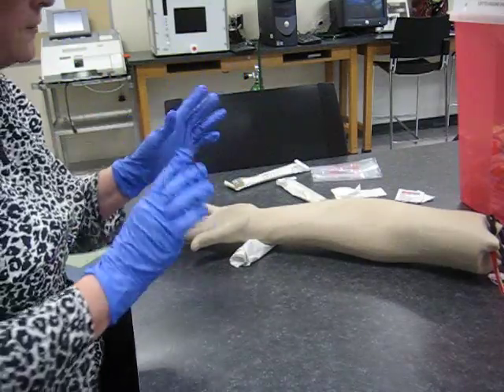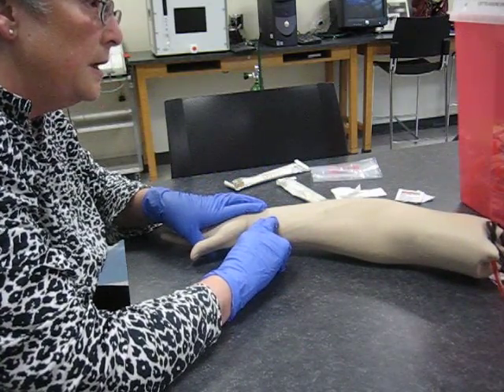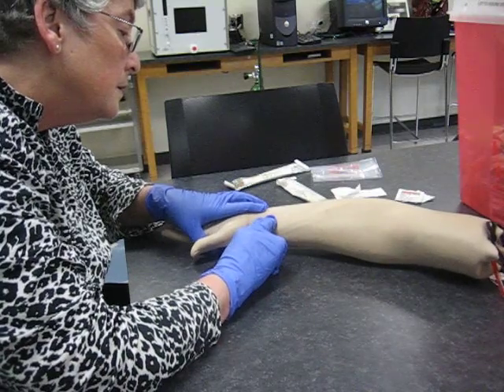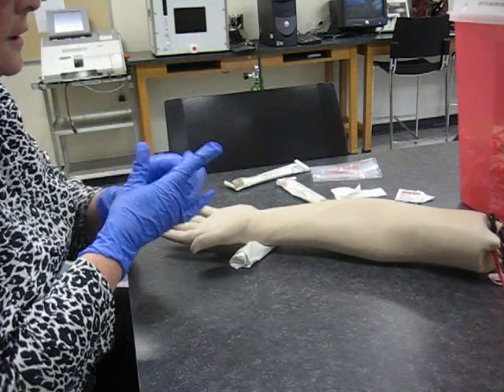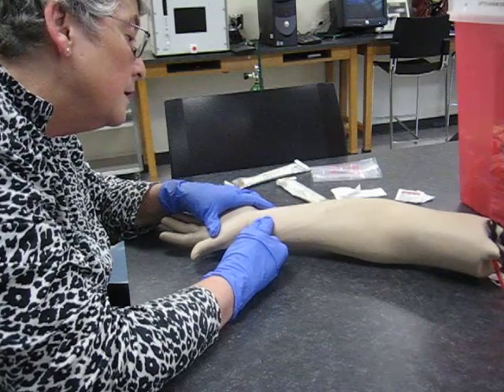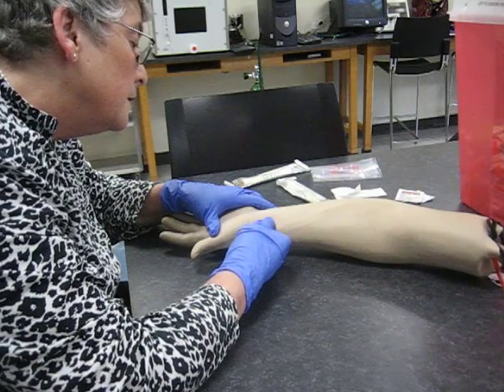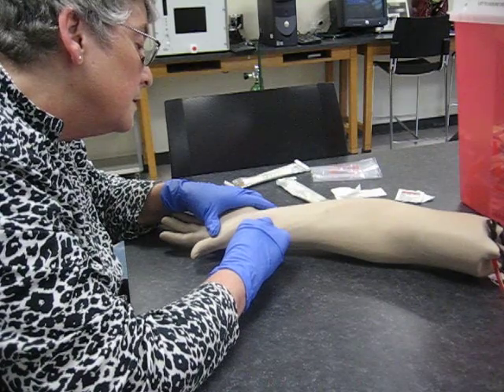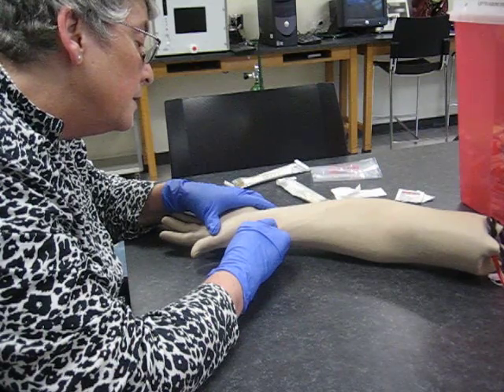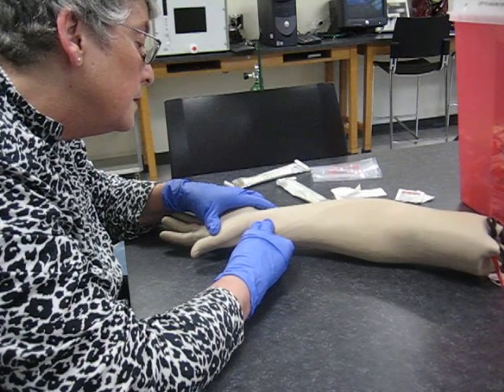All right, Mr. Hand, I do not have the needle yet. I'm going to feel for the artery with my finger — I will tell you when I go to stick. I need to have some blood pressure. I can't stick here until I can find an artery. There, I feel it.